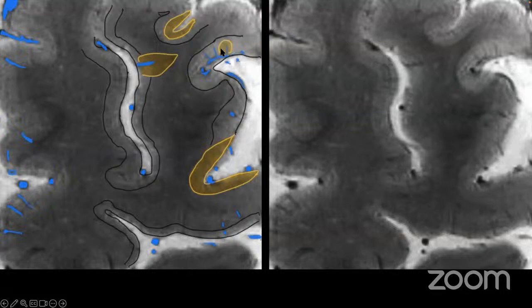One type of lesion is called the intracortical. It happens as any other white matter lesion around the central vein and stays within the cortex. This is called the intracortical one. This is not the most common; this is the least common type. What happens essentially in the white matter happens again in the gray matter, or in the cortex, but this is a rare occurrence, given that the cortex is a tiny strip and it's very difficult to pick it up in any given scan.